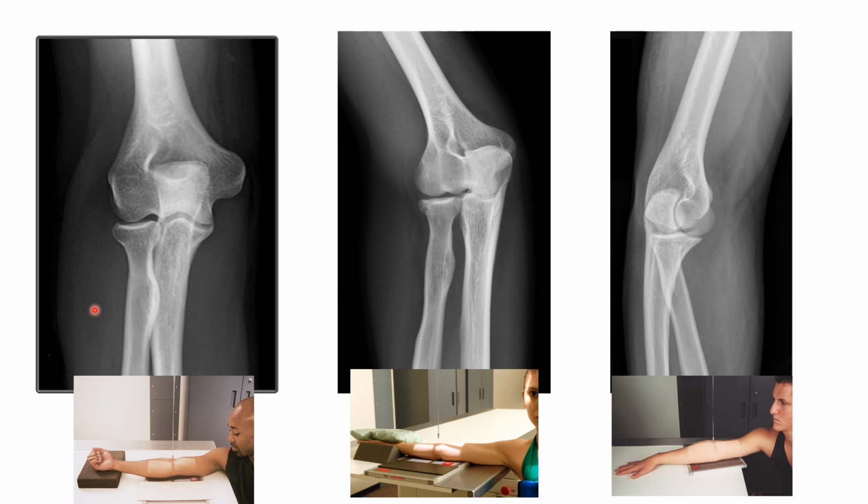This image is done with the patient's entire arm, the upper and lower arm, parallel with the IR, and the interepicondylar line parallel with the IR. The central ray will be perpendicular to the interepicondylar line.